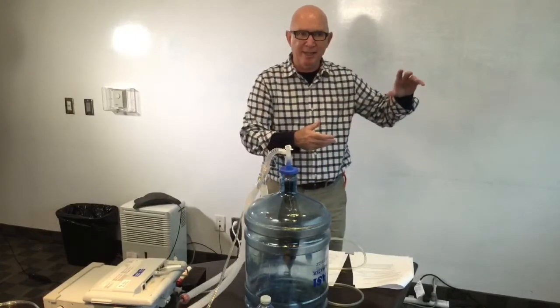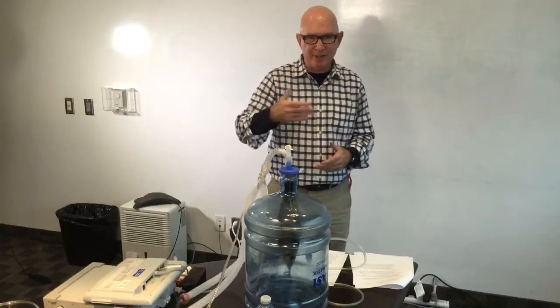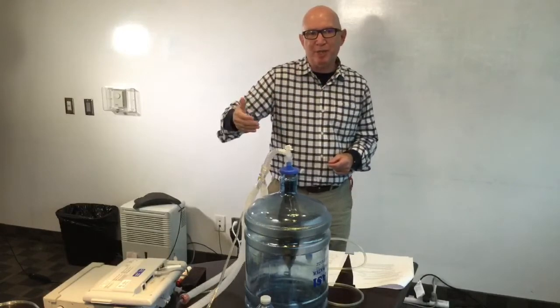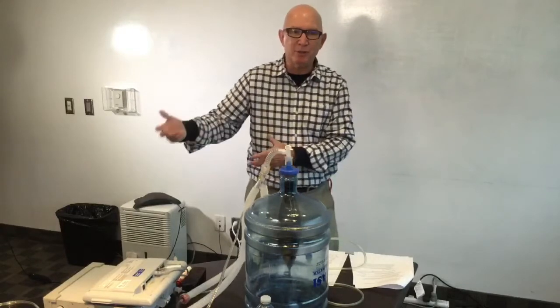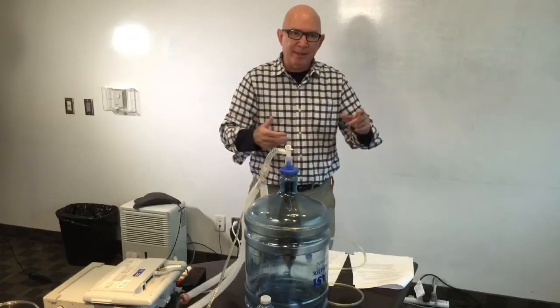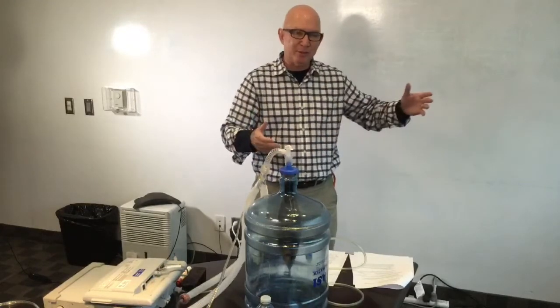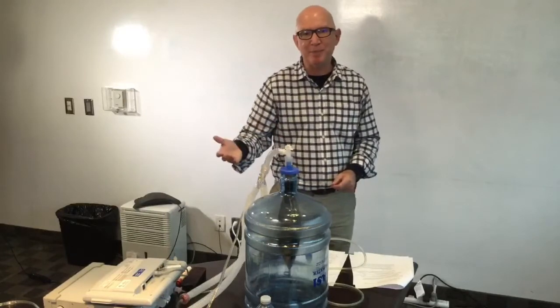So when you get the mechanical breath from the ventilator, if the patient triggers it or if it's a time-triggered breath, it doesn't unload the respiratory muscles in comparison to the spontaneous breath that they might have with pressure support. So the interesting thing was that what we thought we were doing in unloading the respiratory muscles, or loading them for that matter, while we were decreasing the rate, wasn't exactly what was happening.